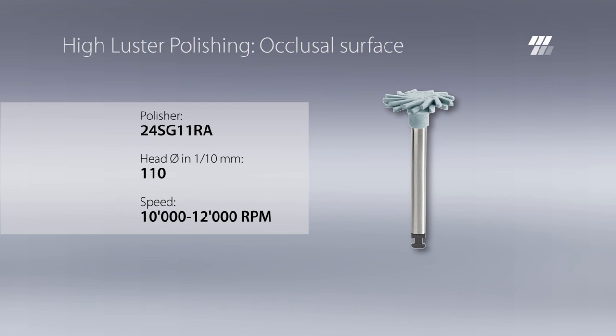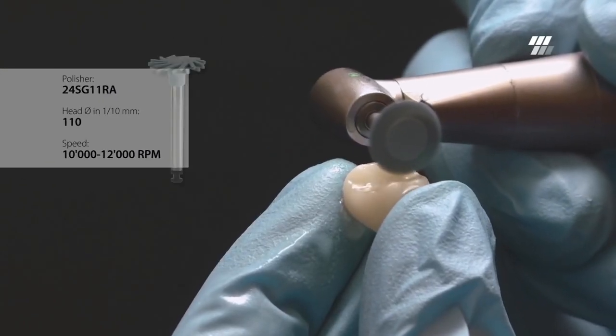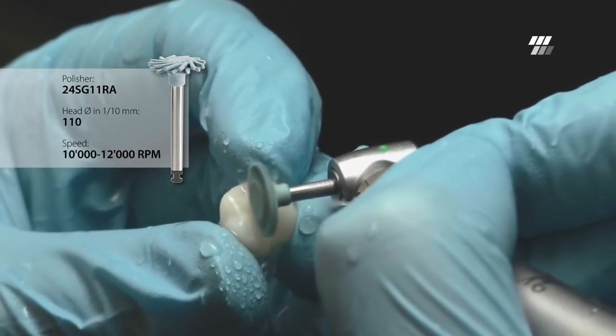For high luster polishing of the composite, use Diatek ShapeGuard Comprashine Plus. Comparable to the first step, polish the occlusal surface, fissures and cusp slopes with the head diameter of 11 millimeters.